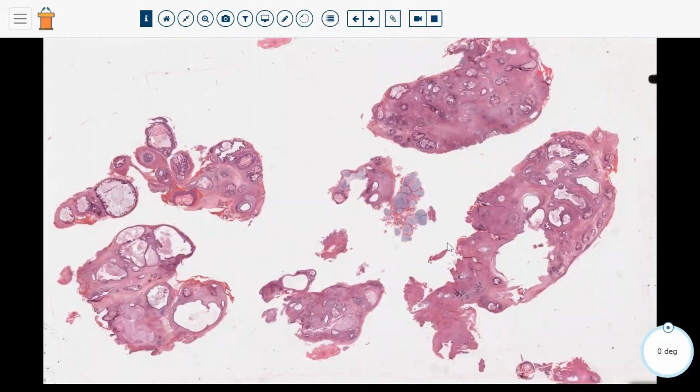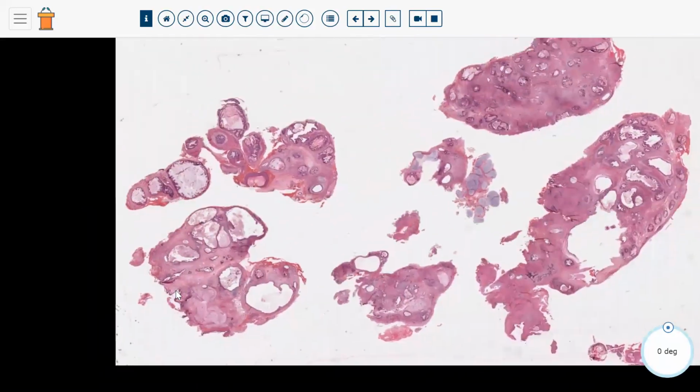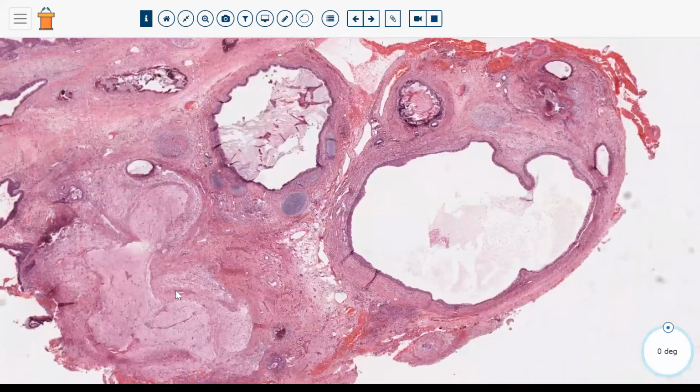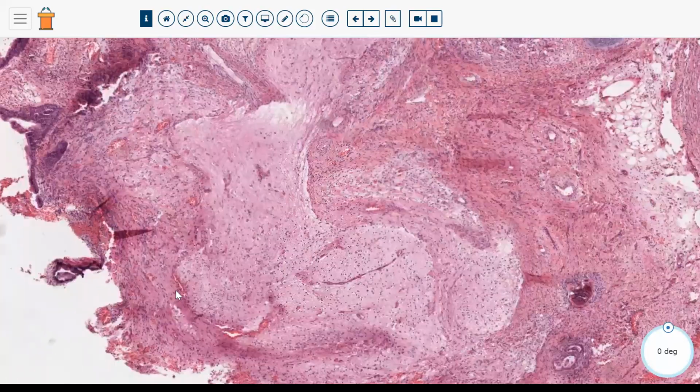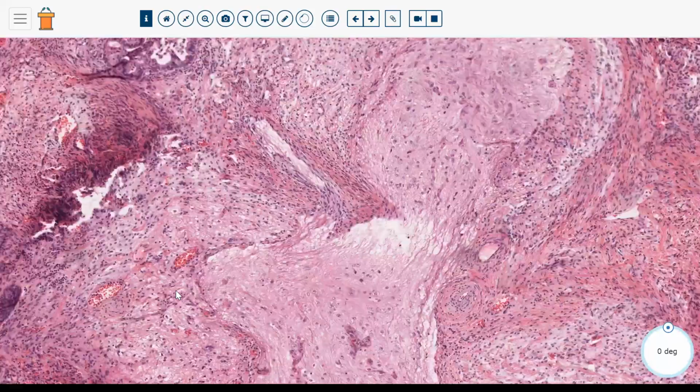This is a fragmented specimen, so something interesting must be going on here. This is unlikely to be an orchiectomy specimen given the fragmented nature of the tissue on the slide. So for example, this could be an incisional or excisional biopsy of a metastatic lesion, say in the retroperitoneum, which would be a common location for metastases of testicular germ cell tumors. But if we look at this, I'm sure you very likely jump to the immediate conclusion that this is a teratoma based on the heterogeneity of patterns that we're seeing here.